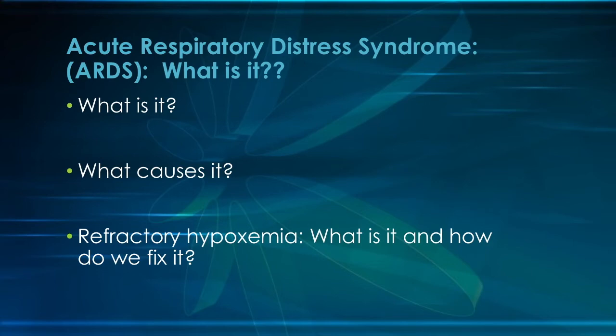So the best way to fix this, of course, is increasing our PEEP and our oscillator, right? So remember I was talking about the oscillator and how it is that very forceful positive pressure, okay? So this is the best way we can treat ARDS, right? In critical care units, you might see things like an ECMO, called a VV ECMO, and that is specifically to help the lungs repair itself. But that is in critical care areas, and we're not really going to talk about it today. But our fixing of this is definitely an increased PEEP and an oscillator, most likely.